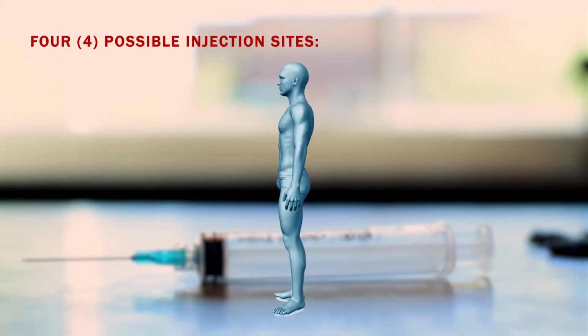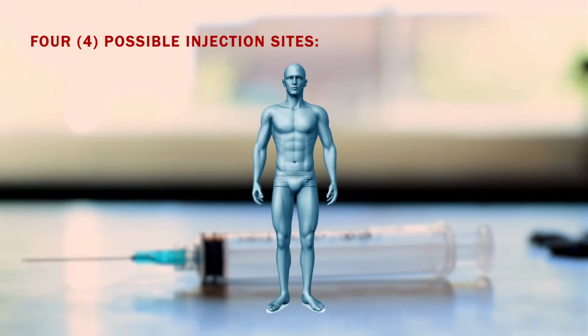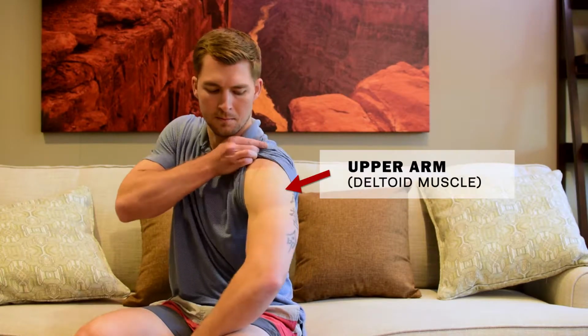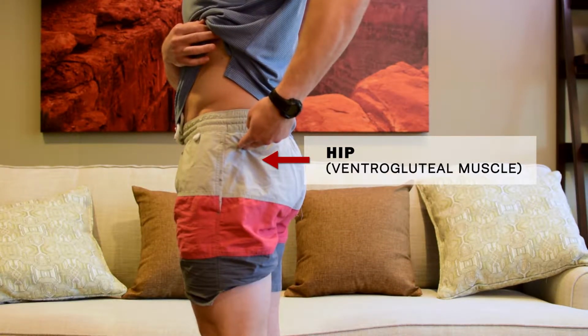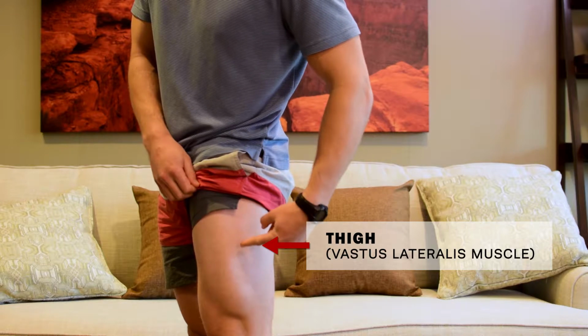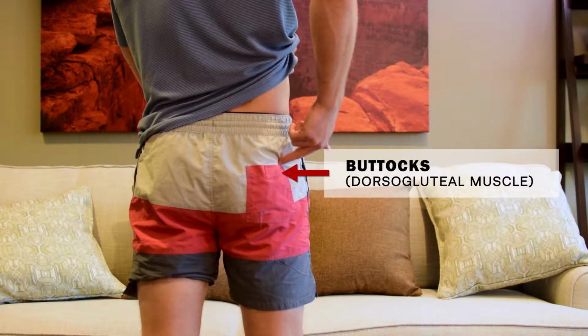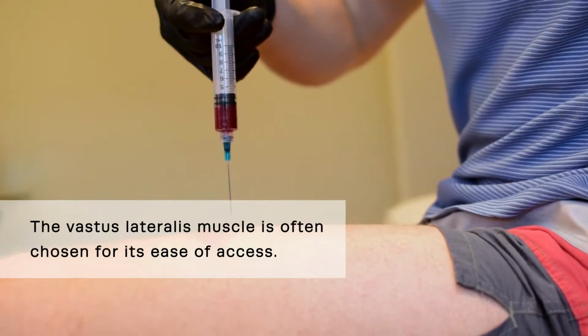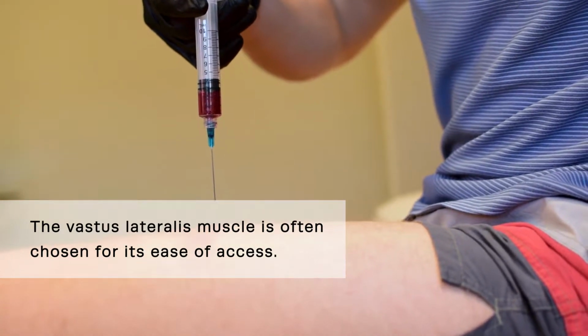On a human body, there are 4 main sites that are considered safe and effective for IM injection administration: the upper arm, the deltoid muscle; the hip, the ventrogluteal muscle; the thigh, the vastus lateralis muscle; or the buttocks, the dorsal gluteal muscle. For self-administration, the thigh, vastus lateralis, is typically used because of its ease of access.